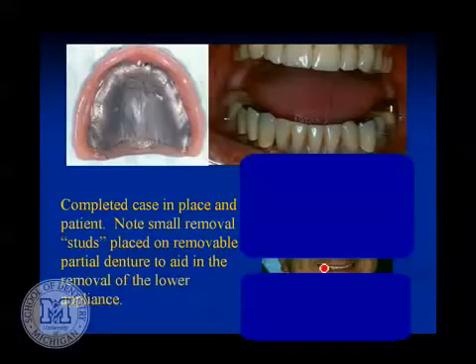So upper metal base, people will sometimes say, why do you bother to do an upper metal base denture? Occasionally with patients, if I've got an upper denture and lower natural teeth, patients can develop enough occlusal force if they've got lower natural teeth that they crack the upper denture. And so if you repeatedly are repairing an upper denture that's been cracked, teeth have been gone for some period of time, so you don't anticipate the need for a reline at short intervals. If you make a cast metal base, we used to do it in either gold or chrome cobalt. With the cost of gold now, it's pretty much always chrome cobalt. Then you go ahead and you wind up with a denture base that you don't have to worry about breaking. So we get the thing done and put in.